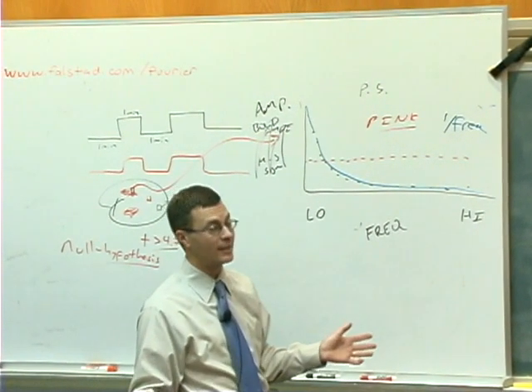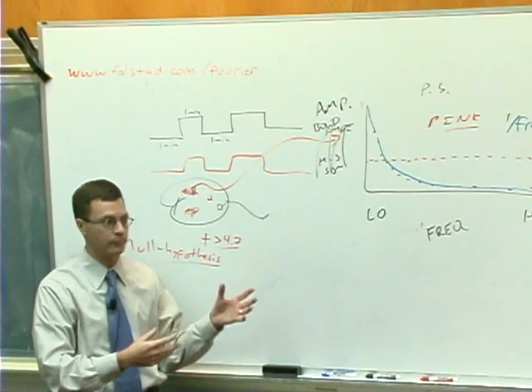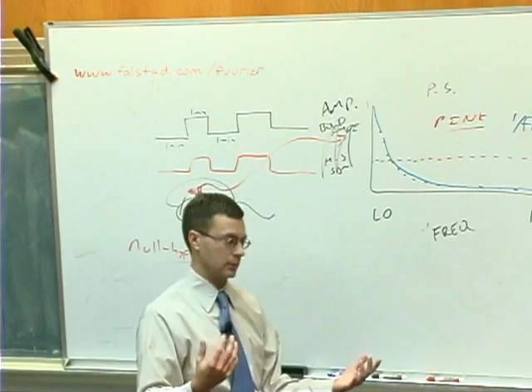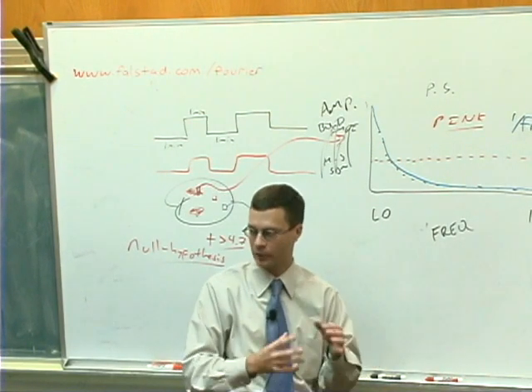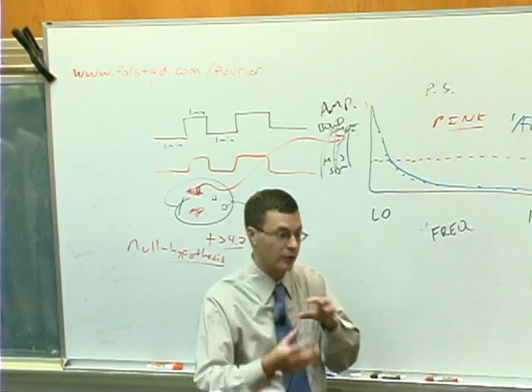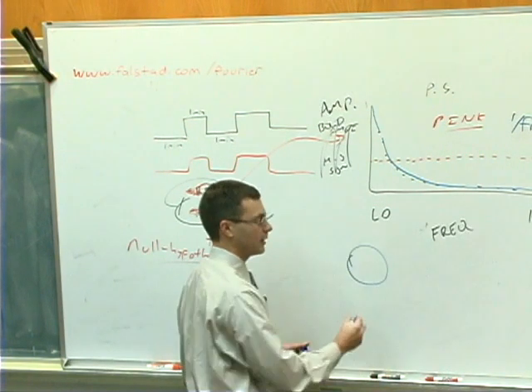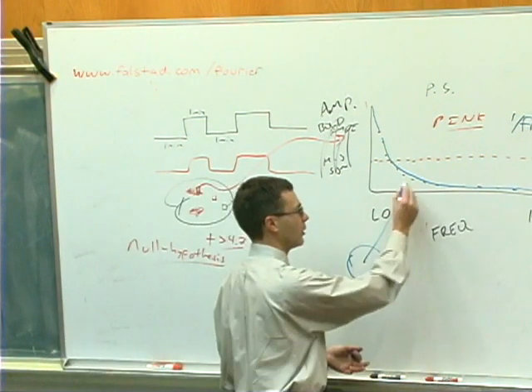People ask, where does this 1 over f noise come from? If you look in the literature, you'll find that all sorts of complex systems have 1 over f noise: the collision of galaxies, bidding on the stock exchange. And people say, maybe the brain's a complex system, with thoughts racing back and forth, and that's why there's 1 over frequency. Well, sorry, actually, if you just take a plain old jug of water, a spherical phantom, put it in the scanner and collect BOLD fMRI data, you will see 1 over f noise.